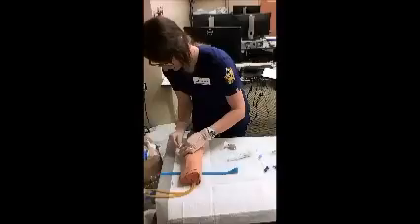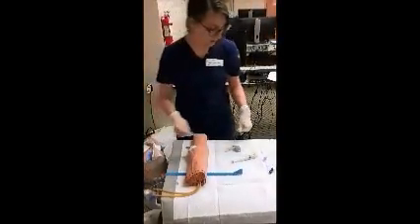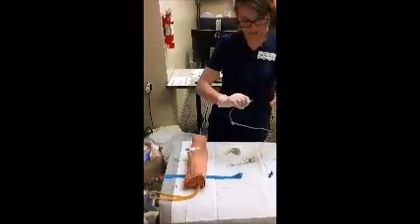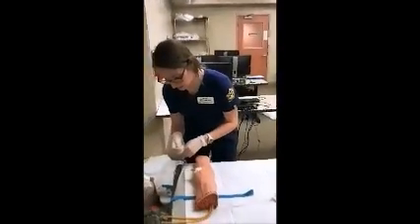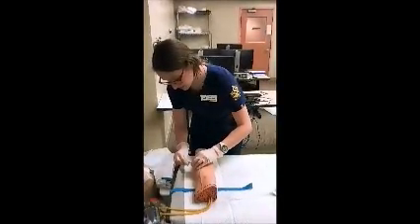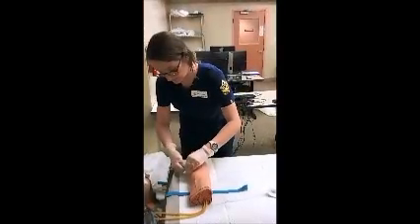Make sure that that's good and clean. If it's already saline locked, we've just done the flush. We can go ahead and unhook that. Okay, so we're going to go ahead and throw that out. And then we're going to come over to our sterilized hub here, and we'll stabilize and insert that in, twisting it on nice and tight.